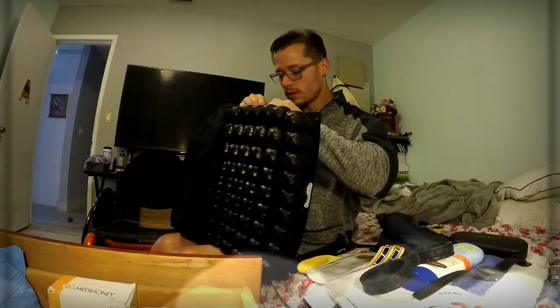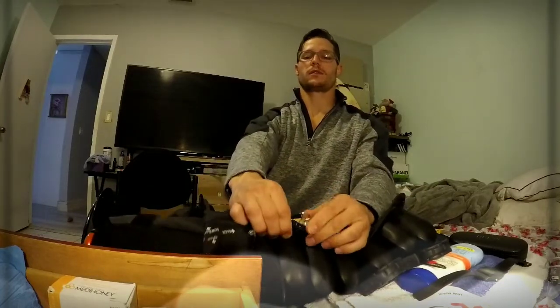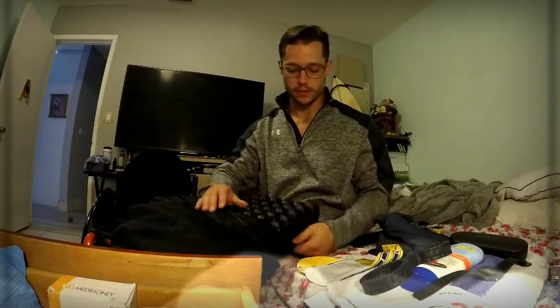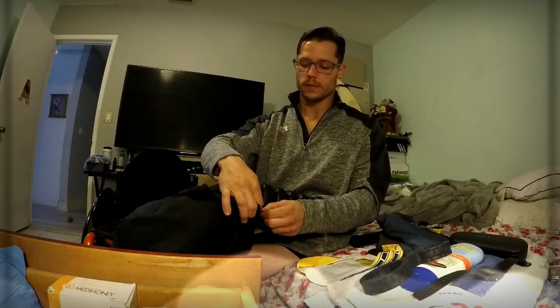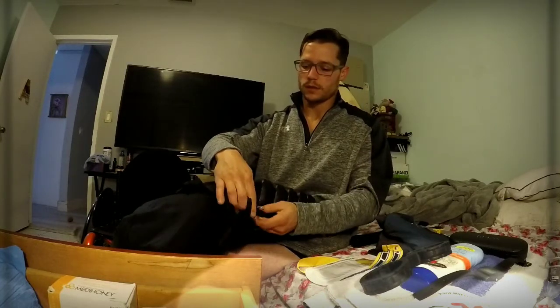So I bend it, I fold it, and then I clamp it or crimp it. And then you do it to the other side. So this keeps the air in the back the way you want it, and then I'm able to take air out from the front so my legs are a little better positioned. And I should be putting shoes on to do this, so when I'm out and about it's adjusted to my feet.